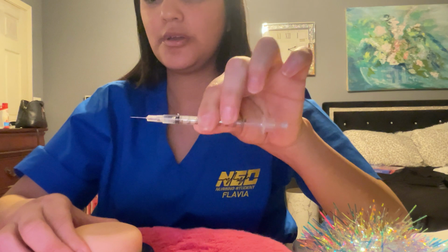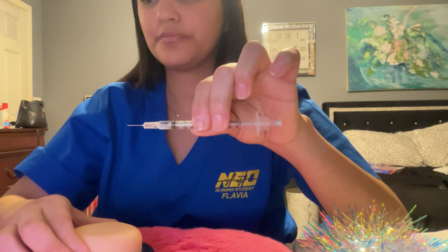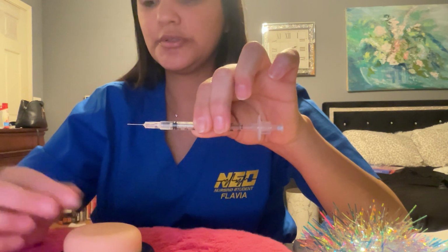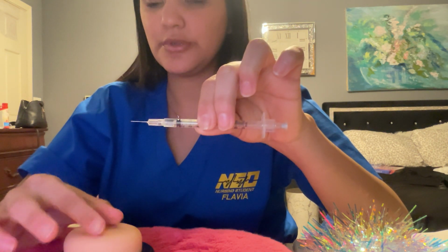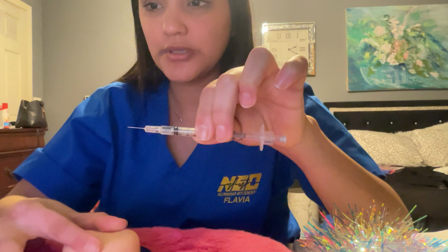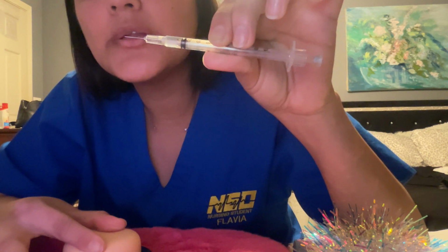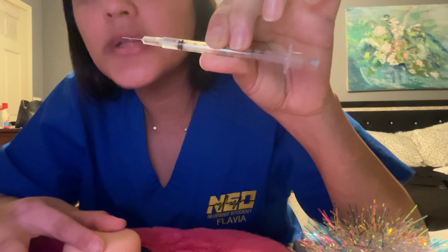So just like that, and the needle is facing up. You spread the skin with your fingers like this, and you want to make sure the needle is facing upward, just like that.